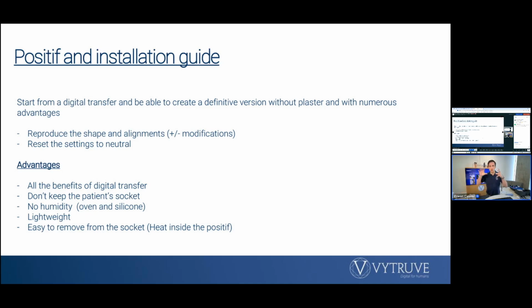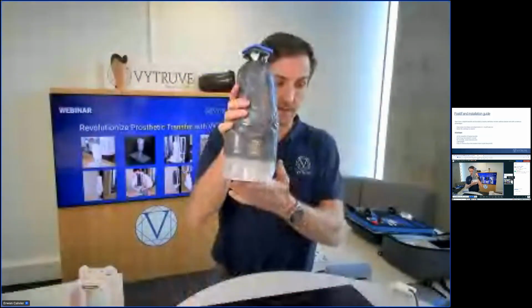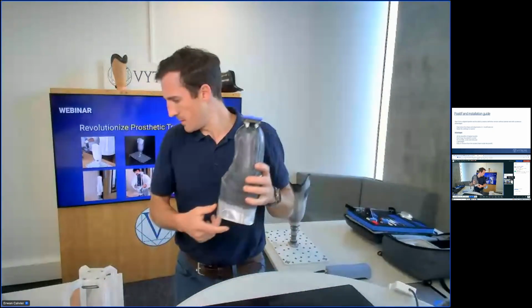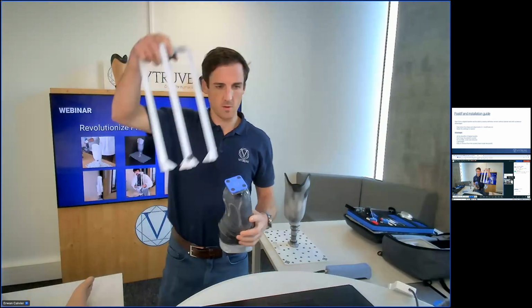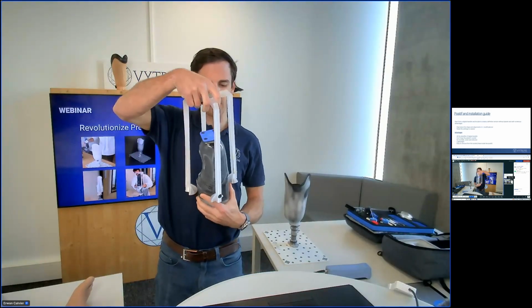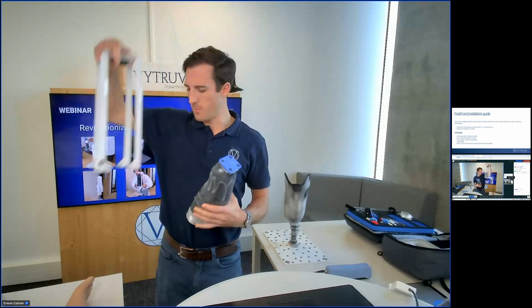So when you do your lamination, for example, this one, I did the first lamination directly on it. You can see that I have the injection tube. I can position this to position the 4-hole plate.